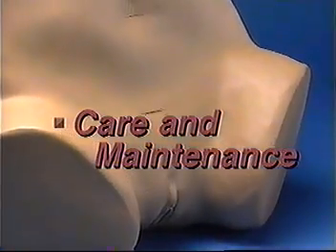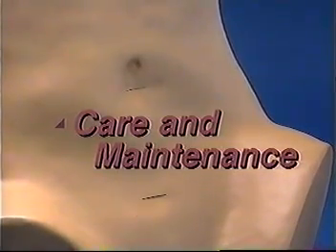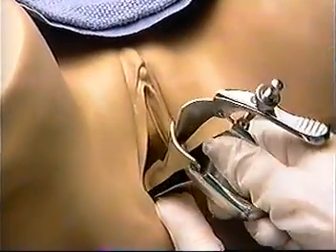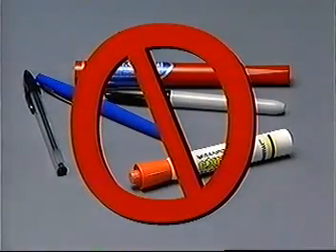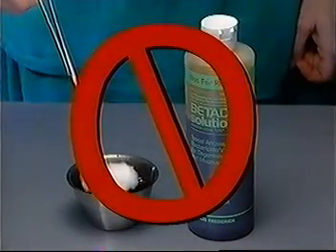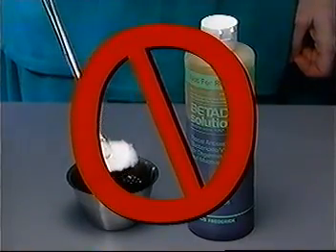Care and maintenance. In handling the model, use the same gentle techniques you would in working with a client. To avoid tearing ZOE's skin when performing a pelvic exam, use a dilute soap solution to lubricate the instruments and your gloved fingers. Do not write on ZOE with any type of marker or pen, as these marks may not wash off. Do not use betadine or any other antiseptic which includes iodine on ZOE, as they will stain.